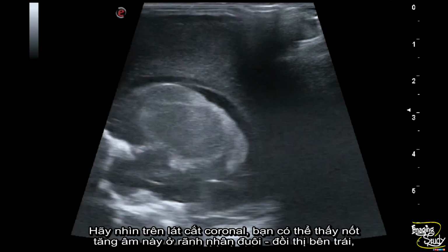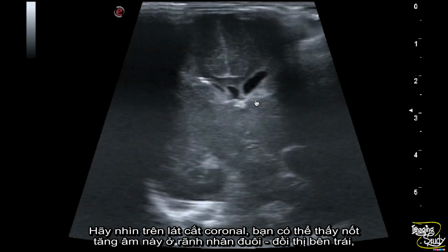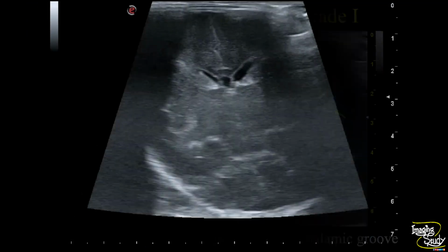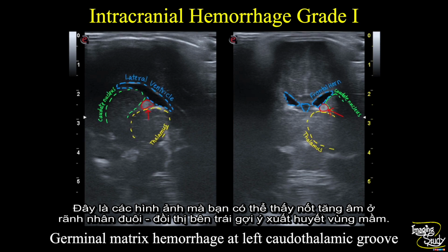Let's see on coronal section, you can see this hyperechogenic focus at the left caudothalamic groove, indicating it as a case of grade 1 intracranial hemorrhage. So here is the picture. You can see the echogenic focus at the left caudothalamic groove, indicating the germinal matrix hemorrhage.